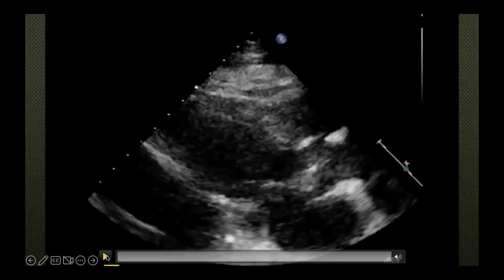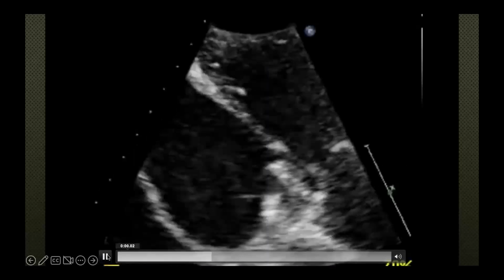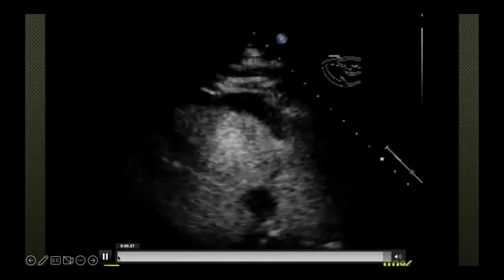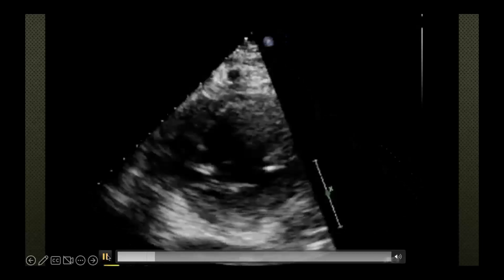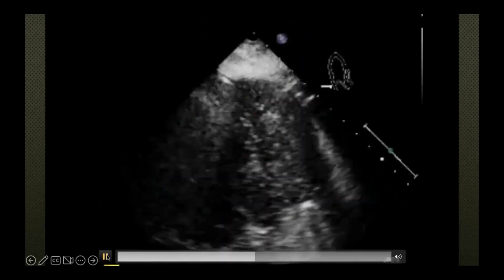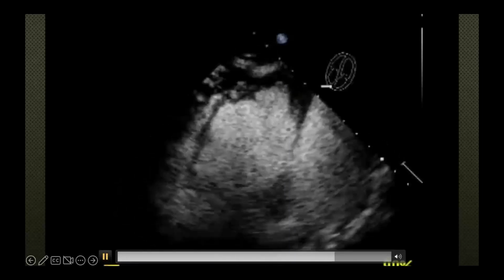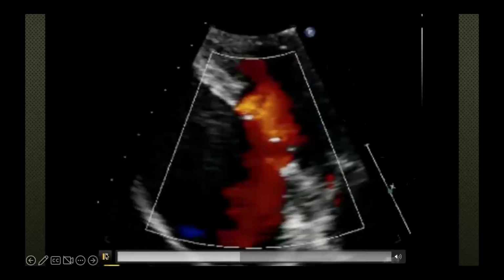And this is a very dramatic case if you look at the echocardiogram, where from the get-go you can see the inferior wall is akinetic, and you can see the flow. In contrast, I'm just going to repeat it again. Yeah, so you can see here there is an effusion. The inferior wall is akinetic, and you can see the bidirectional flow by the color Doppler and the contrast images. So actually, this patient survived and went for urgent surgical repair.